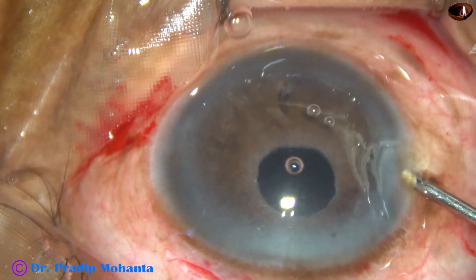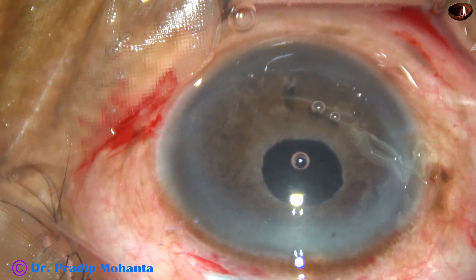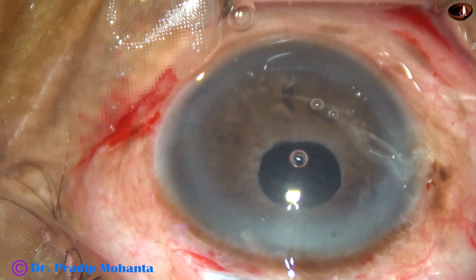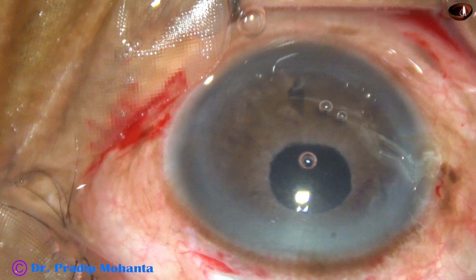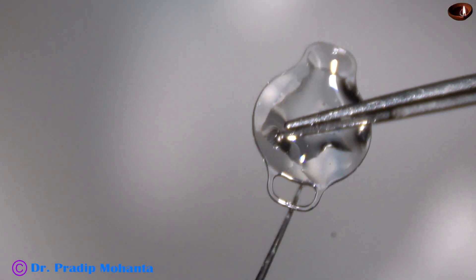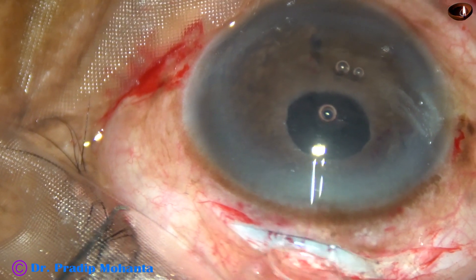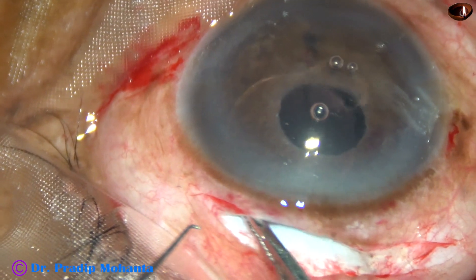And now I inject viscoelastic in the anterior chamber over the iris. And now my plan is to place the iris claw lens. I check the haptics — both haptics are checked. The lens is placed over the iris with the help of McPherson's forceps.